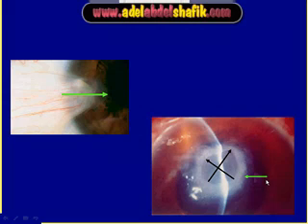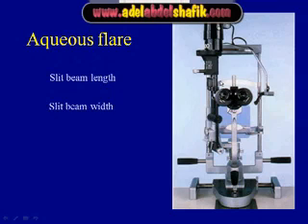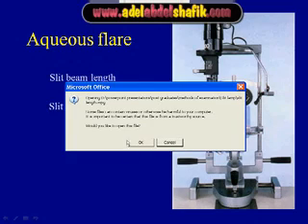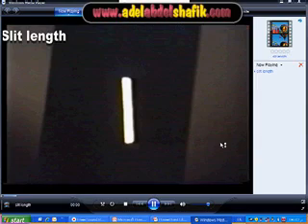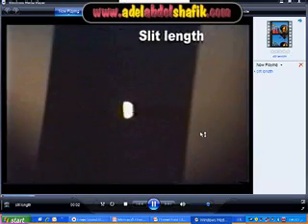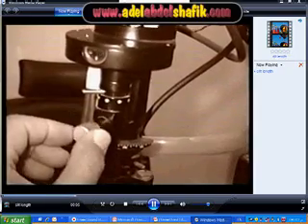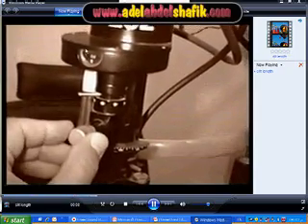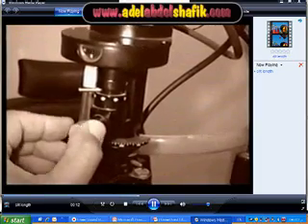You can measure a lesion from the limbus — how far it is from the limbus or the diameter of the lesion itself. The slit length can be taken from this part of the slit lamp. If you change the length, you can read the number of millimeters here, which equals the length of the light.